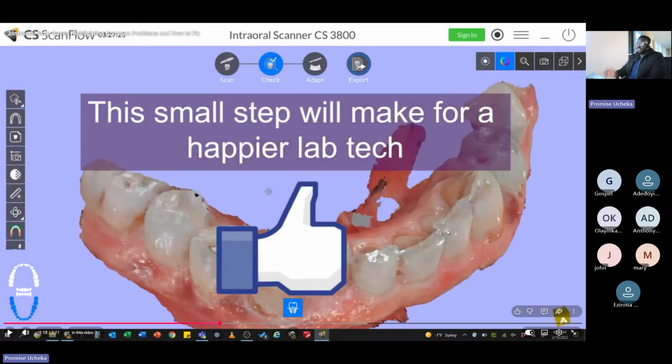So again, because this is digital, when you see a problem, you can actually fix it.